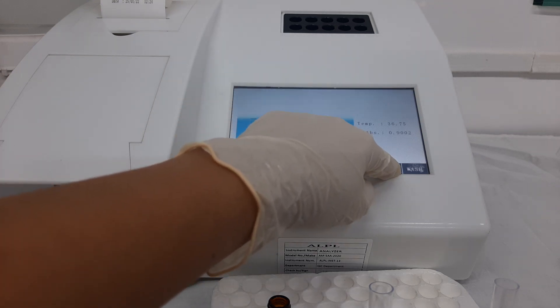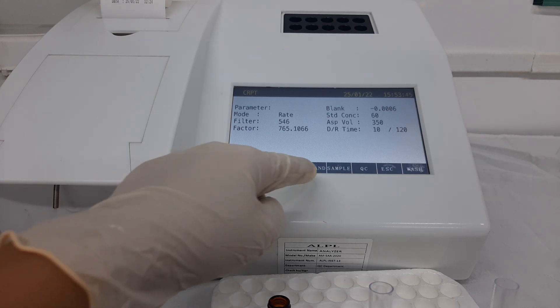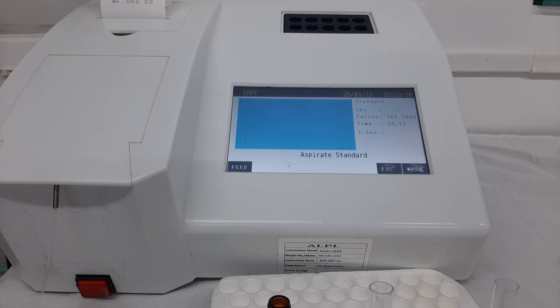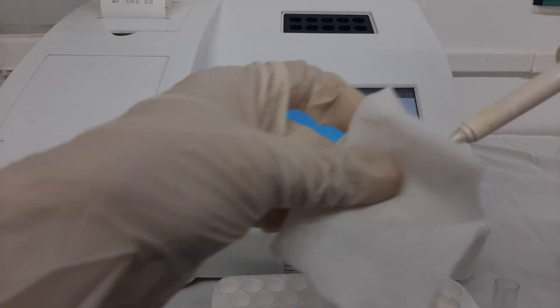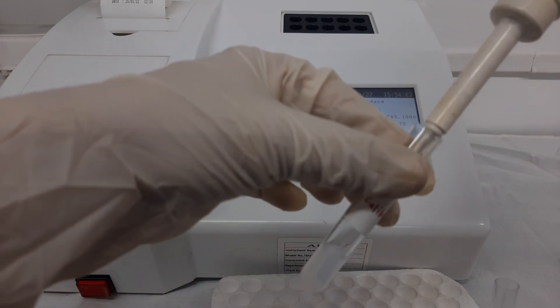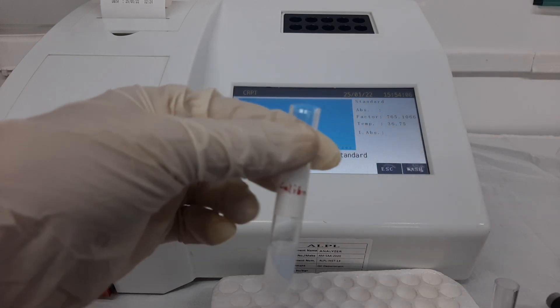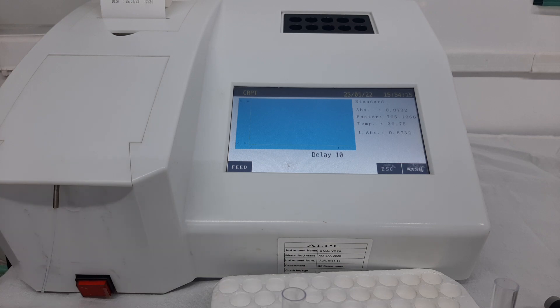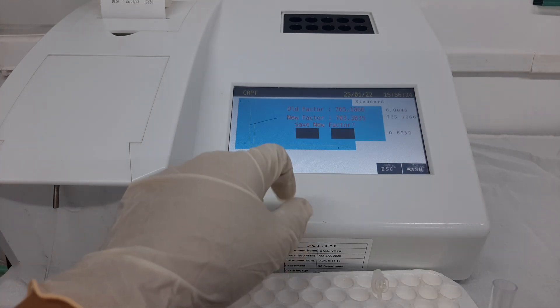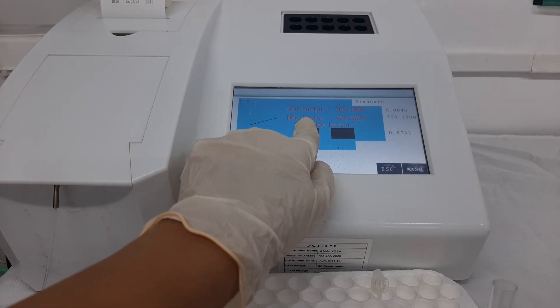After the incubation time is over, press the escape button and come back to the home screen. Next, select the option of standard to run the calibrator tube. Take the vial of calibrator provided in the kit and aspirate 5 microlitre, then rub the outside of the tip with a clean tissue paper. Add this 5 microlitre of calibrator into the second tube and mix. Aspirate the reaction mixture into the flow cell. A delay time of 10 seconds is initiated, followed automatically by a read time of 120 seconds. After the read time is complete, the software will display the new factor and ask to save it — select yes.